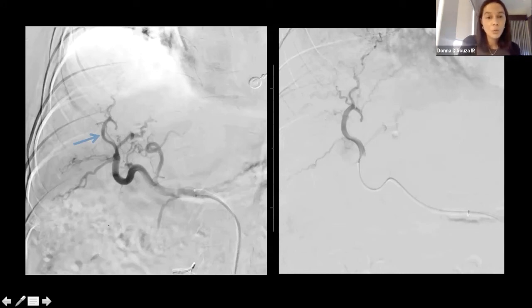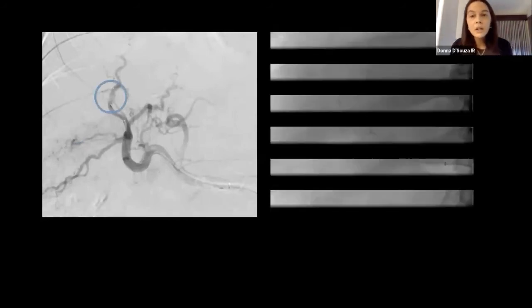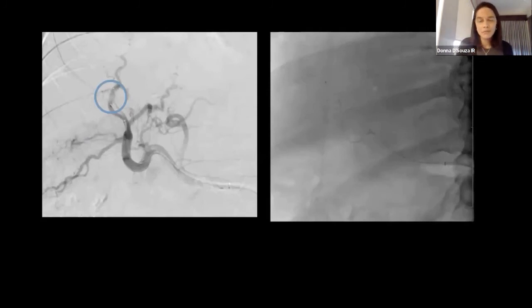What you can do here is, there's actually an MVP plug that has not been detached sitting in there. The way we use this technique is called the double catheter technique. You put in a catheter, typically a guiding catheter. You can use a sheath, and through it you put two microcatheters. One is your delivery microcatheter, and the other one is the one that you put the plug in, but you don't detach the plug, and you temporarily occlude the branch that you want to occlude.